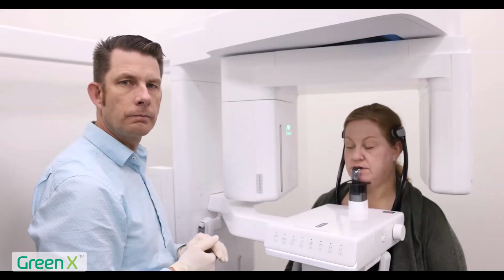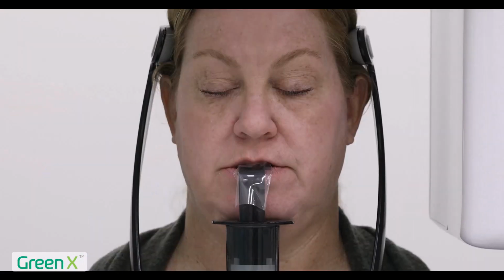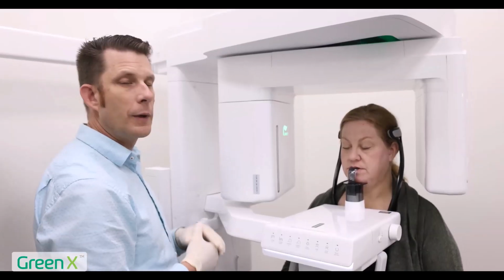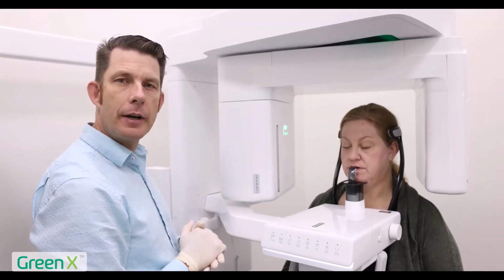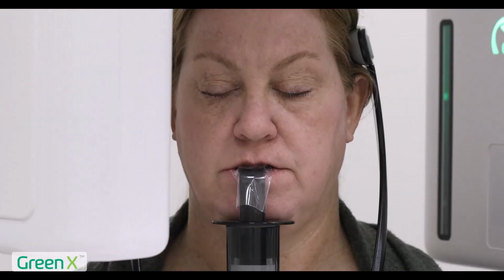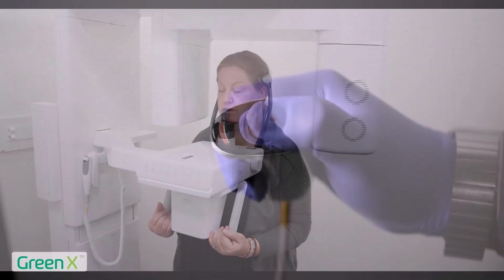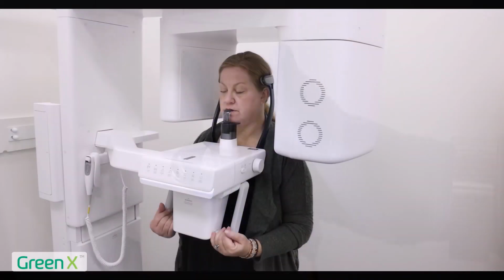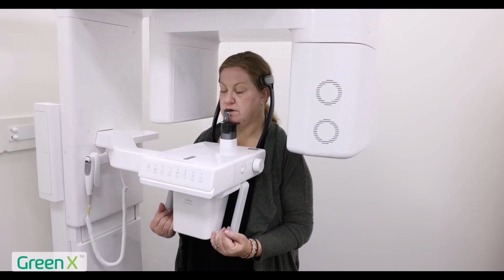The system is ready to capture an image. Please close your eyes until image capturing is complete. We'll now step out of the room and capture our image. Hold the button until the image acquisition is fully complete. Image capturing is complete. Please wait a moment.